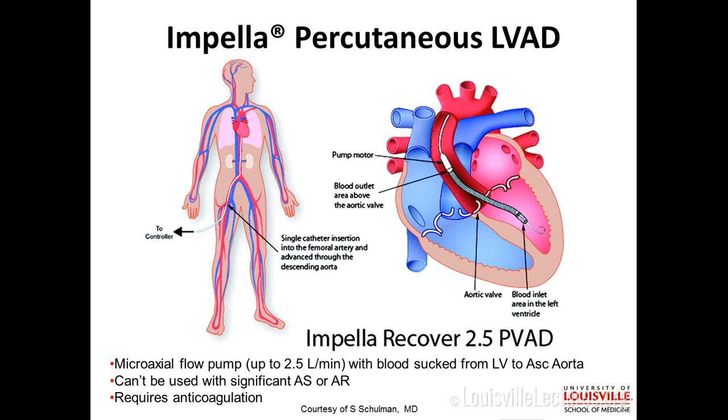So they're trying to find the VT, and so they have to put the person into VT for long lengths of time. How well do you think that's tolerated, especially for someone with a bad heart? Not very well. So we'll often put in the Impella for support before a high-risk procedure like a VT ablation or even a high-risk PCI. So if I'm going to do a high-risk PCI of the left main, you might put in this device to provide support during the procedure.